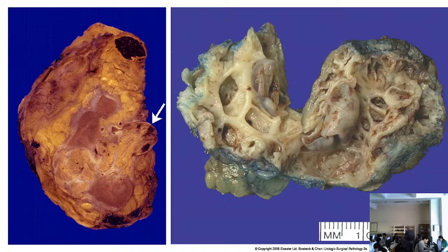It is an organ that has a lesion. Which organ can this be? Taking into account the location. We have the kidney, we have the perirenal fat, and then we have that organ there which has a lesion. Which is this organ? Which is above the kidney? What do you think? Edmund, which is this organ that stays up there? The adrenal, yes, the adrenal gland.